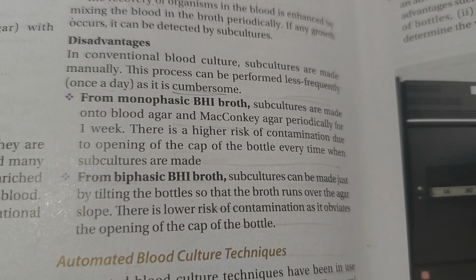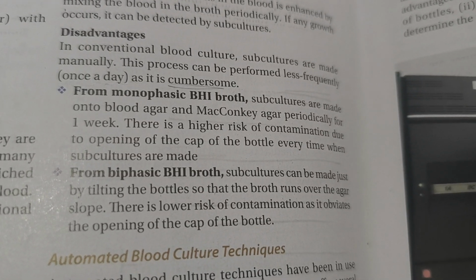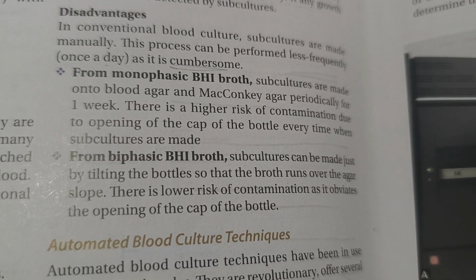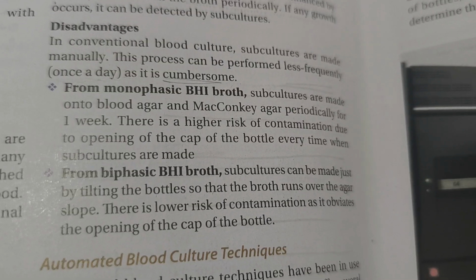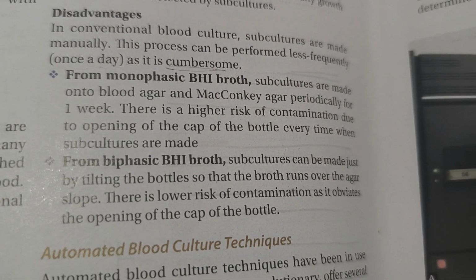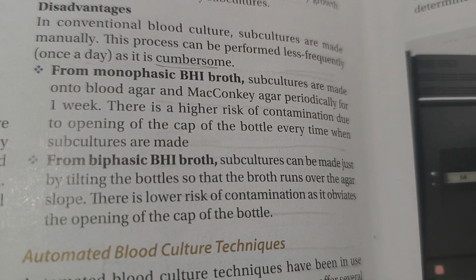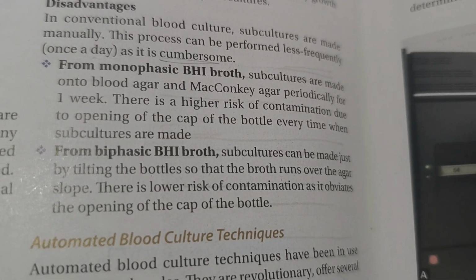This process can be performed less frequently, once a day, and it is cumbersome. From monophasic BHI broth, subcultures are made onto the blood agar and MacConkey agar periodically for 1 week.